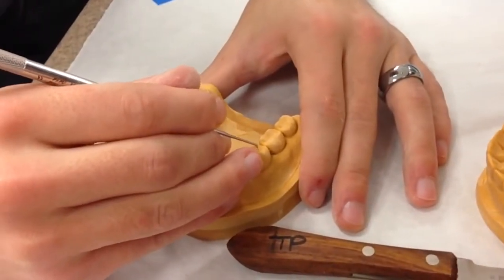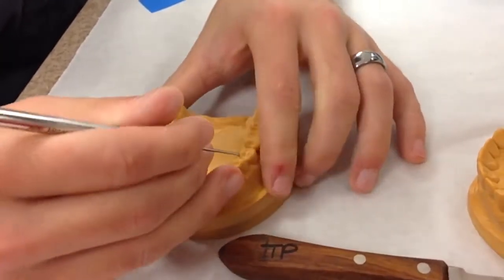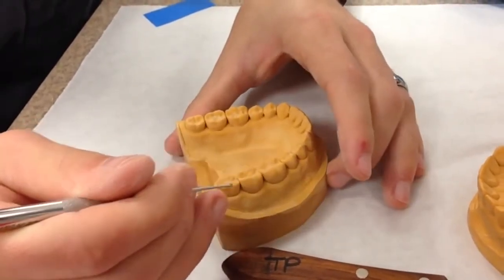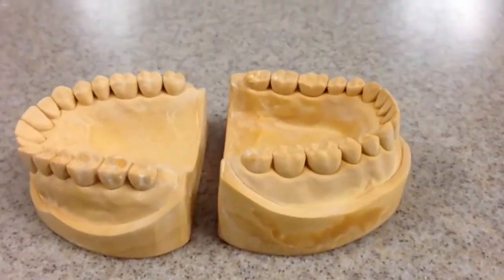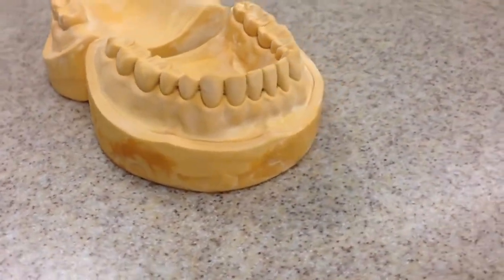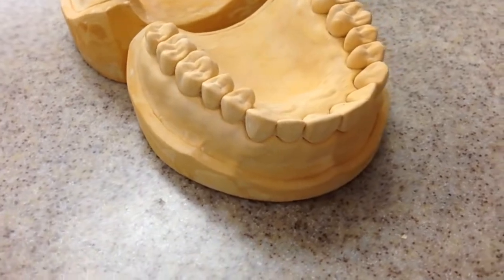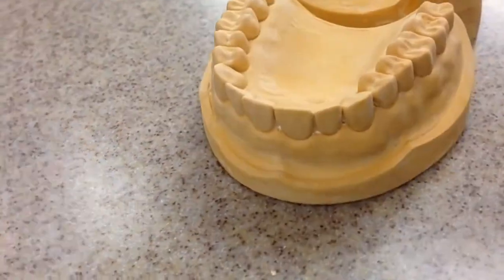The final step is to remove any blebs on the occlusal surface and anywhere on the patient's anatomy. You can do this with your waxing tools. The final product should look something like this. Do you see the land area? There are no blebs, no holes — everything is filled in and smoothed out with some wet sandpaper. Great job on your first cast, and remember: practice makes perfect! Until next time, D1!